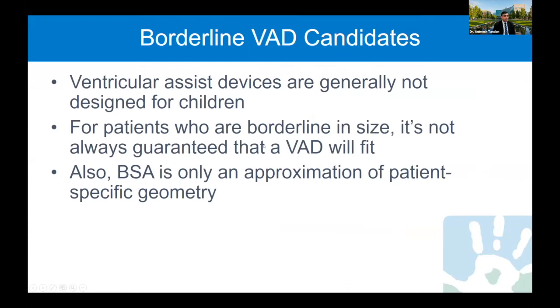Dr. Adebo mentioned VAD candidates. I'll go into that in a little more detail. Here, in children, they're borderline BSA from the FDA clearance for the devices. And basically, it's not always guaranteed that a VAD will fit, and BSA is only an approximation of patient-specific geometry.